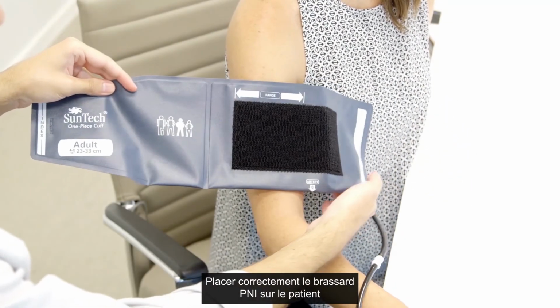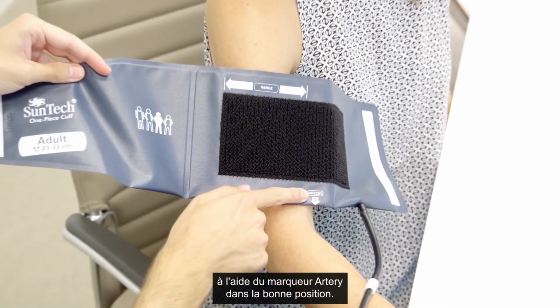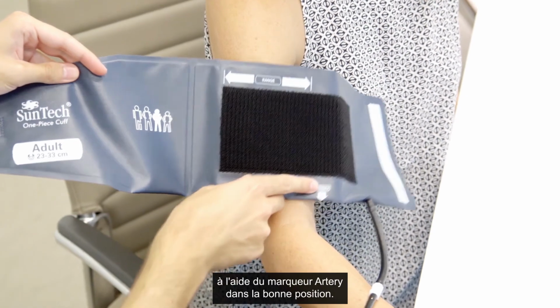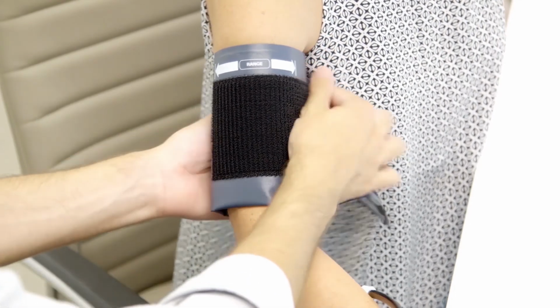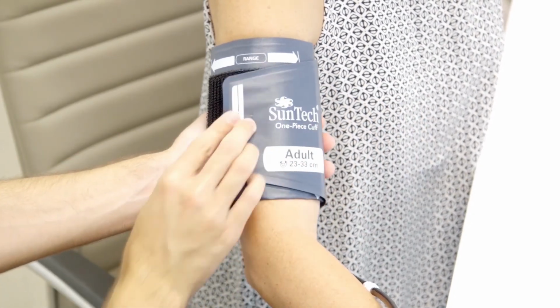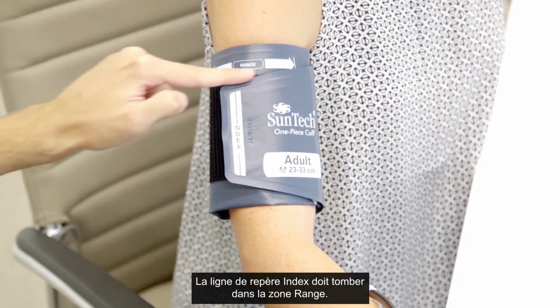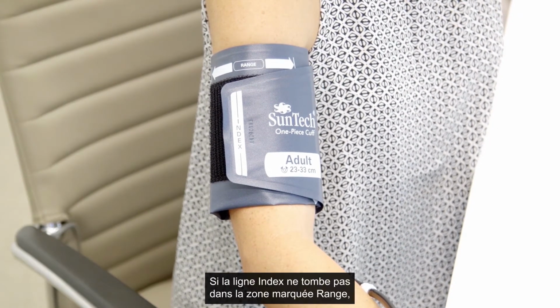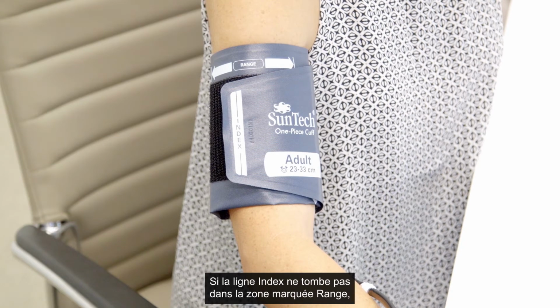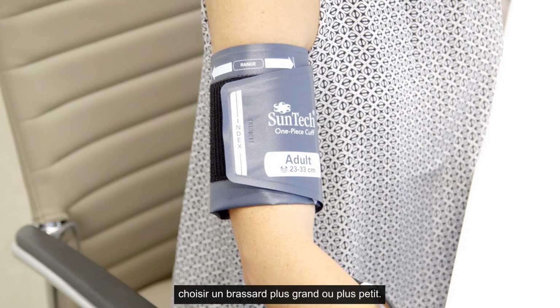Properly place the blood pressure cuff on the patient with the artery arrow indication in the correct position. Wrap the cuff around the arm. The index line should align with the cuff range markings. If the index line does not fit within the range markings, select a larger or smaller cuff.